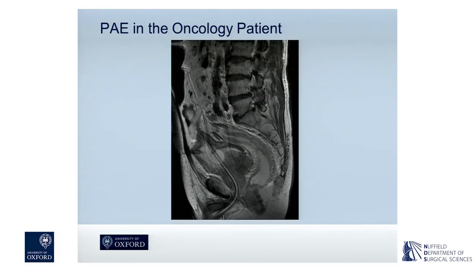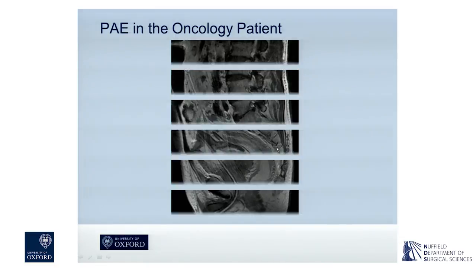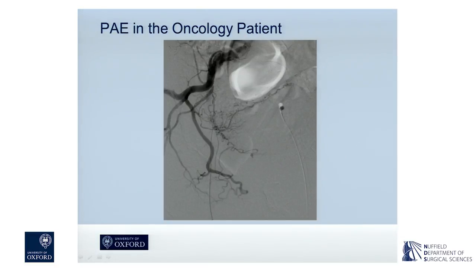Just to show you an example of a patient that we performed prostate artery embolization on who has prostate cancer, and this was the indication of hematuria. So this is a sagittal slice, T2-weighted, large prostate cancer here, which is invading the bladder, coming out posteriorly to almost touch the anterior rectal wall here. And if you thought that the arterial anatomy for benign disease was difficult, the arterial anatomy for prostate cancer is even worse, because you can see there's multiple parasitized vessels supplying the gland with collateral supply here to the superior vesical artery. So it really is tiger territory.